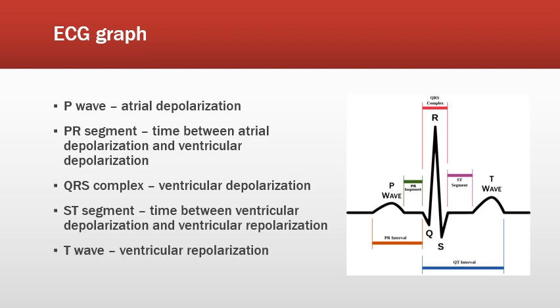The next part of the ECG is where the ventricles contract. Once the AV node is activated, the impulse is carried on into the bundle of His. After the bundle of His, it is carried up the walls of the ventricles through the Purkinje fibers, which causes the ventricles to contract. When the ventricles contract, it gushes blood through the aorta and the pulmonary artery. This is called ventricular depolarization. This phase in the ECG is shown by the QRS complex.